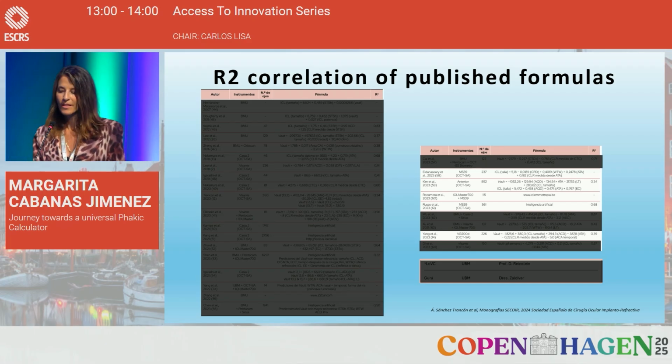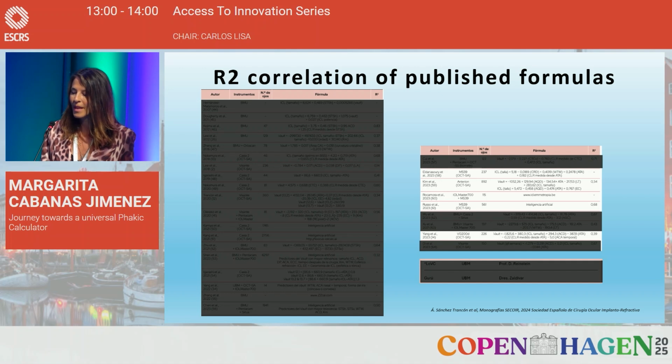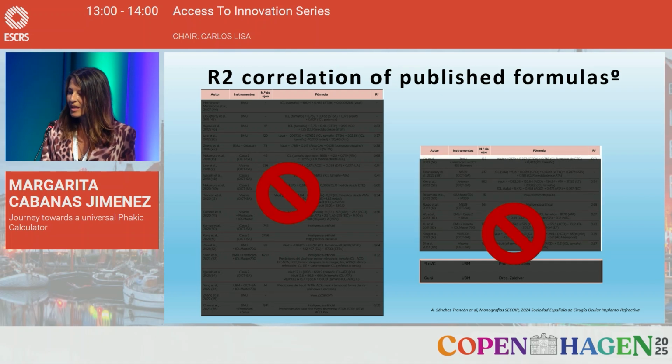If the OCT that you have, as in my case, is not a Visante, for example, I am left with only 4 options. And if you don't have, like me, an MS39 or an Anterion, and use an OCT with an anterior segment module, like Cirrus or Triton, you don't have any other option more than white-to-white based formulas. That is why many of us end up using only white-to-white. Doesn't it?